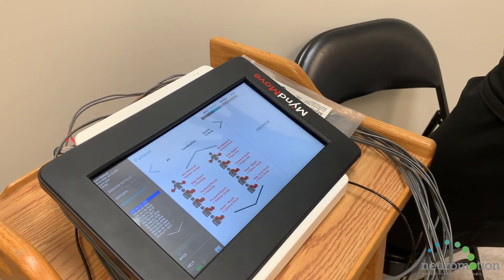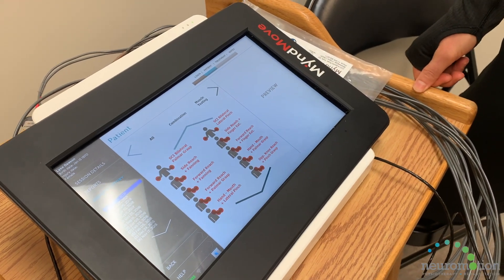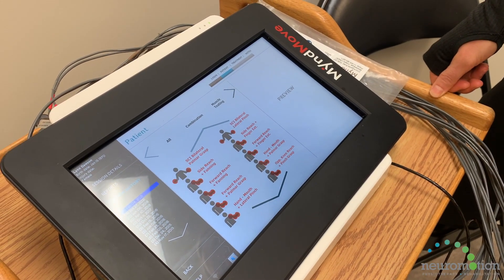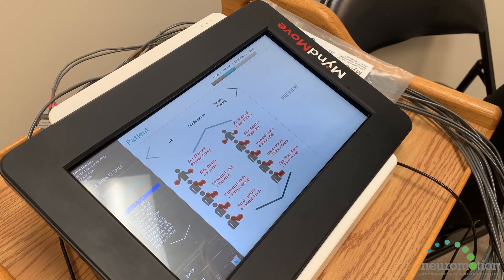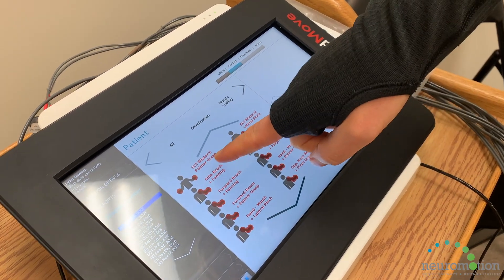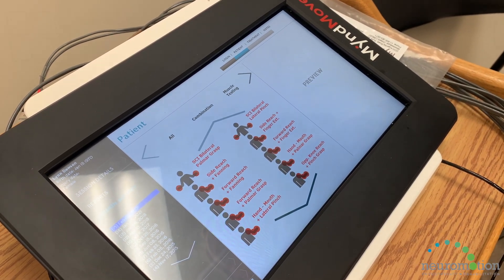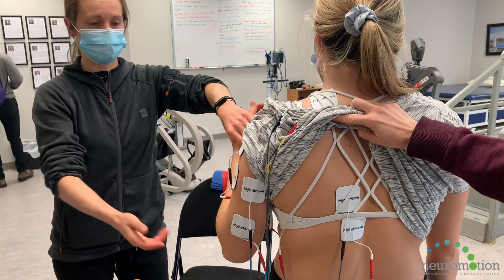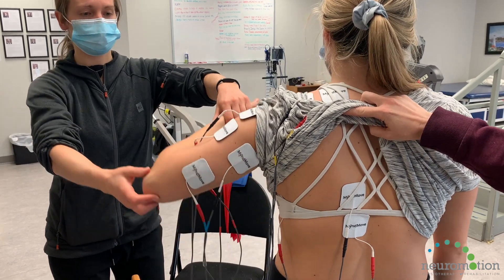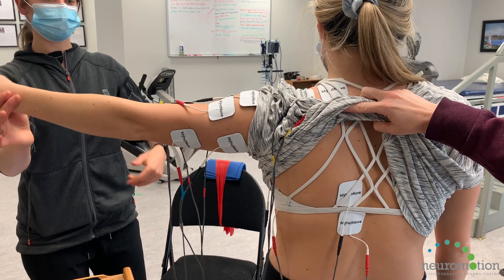The interface shows all the different protocols available with the Mindmove device. If you're working with someone with a spinal cord injury and want to work on both arms, there are bilateral protocols — such as bilateral palm or grasp — for a gripping movement. You can also work on just one arm at a time, which is more common with stroke or spinal cord injury when working individually.